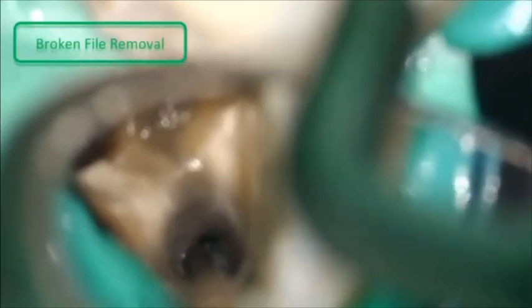So this is after removing substance around the tooth. When you are working at this magnification, 40 times or 25 times magnification, you can see that the preparation is huge. In fact, it's not. It's very conservative when you are visualizing what you are doing and when you see where the tip of the ultrasonic is working.